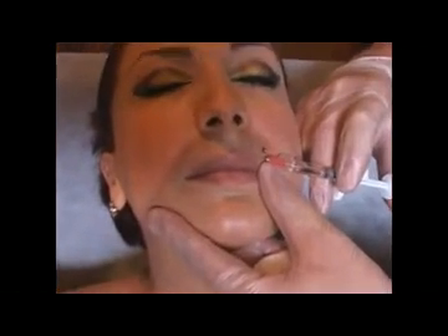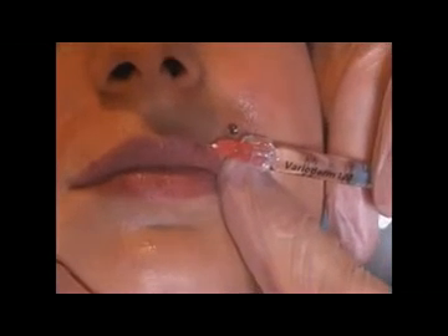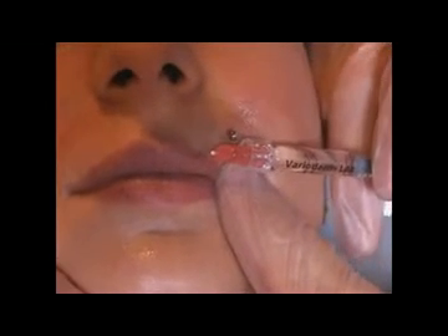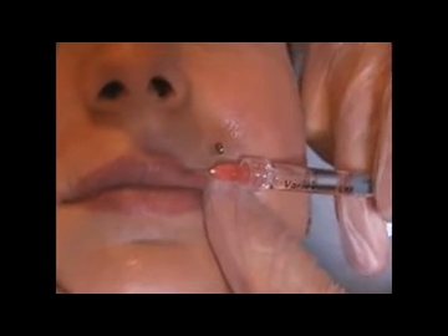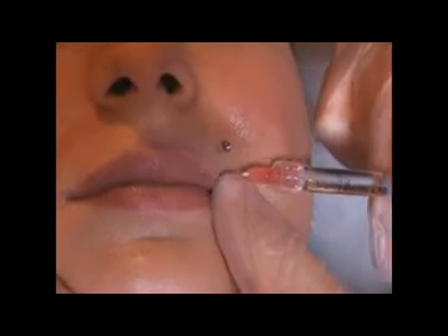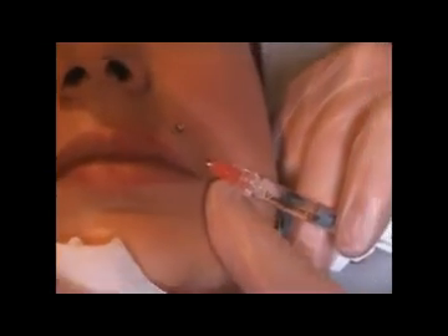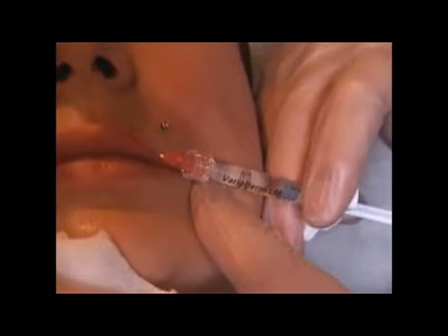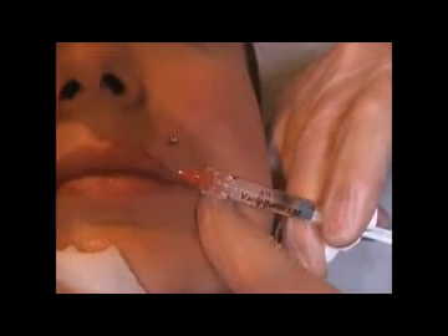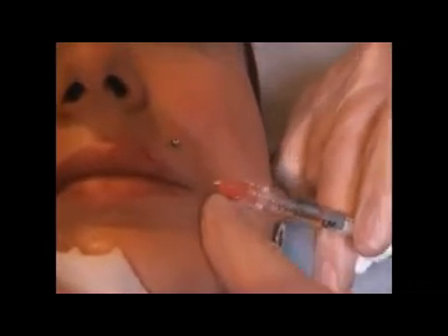I start normally in the upper lip in the middle, go in, pronounce a little bit the philtrum, give a little bit of volume — not too much — and then we check by retracing. You fix the lip; you must always know where you are. You go exactly in the border, go in, inject by retracing, give volume, and then change the angle of the needle and go out.